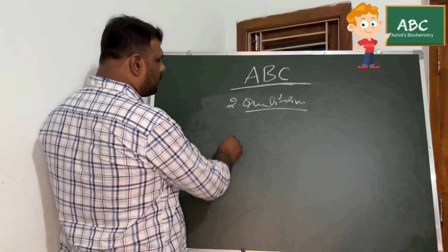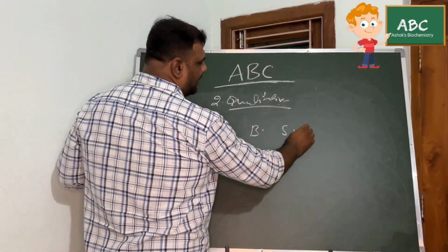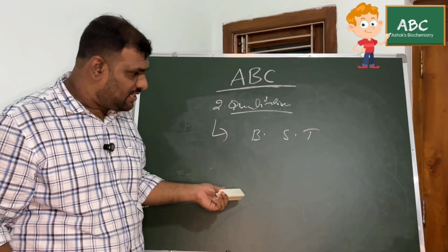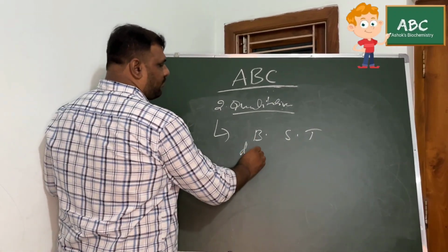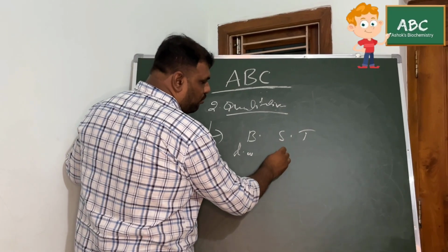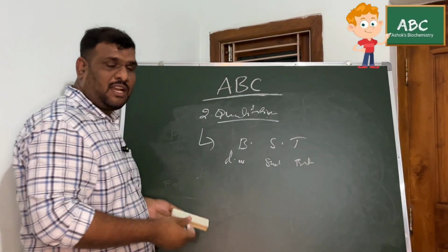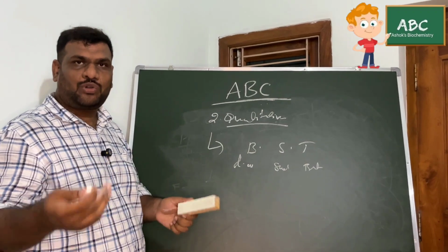So what you're going to do is take 3 test tubes and name them blank, standard and test. In the blank you're going to add distilled water, and you need to state how much you added. In the standard, how much standard you added, and in the test, how much test you added. After that you are going to add your reagent and do the incubation.